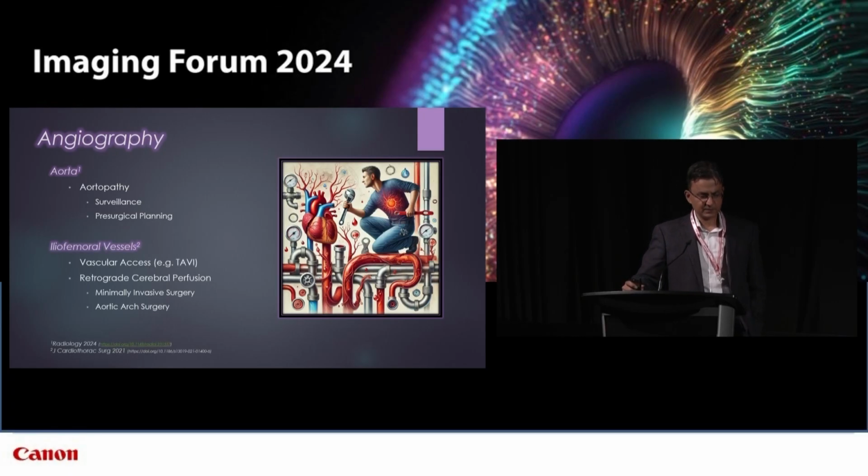Iliac femoral assessment. There are lots of different scenarios where this is actually being sent to us. This initially started back when the TAVI population started to creep up. 2008 is when our program started. And that's really largely driving the question: will the prosthesis and the associated catheters be able to go through the vascular bed? So a lot of that was sizing. How big is the lumen? Can we navigate the vessels to get up to where we need to get to?